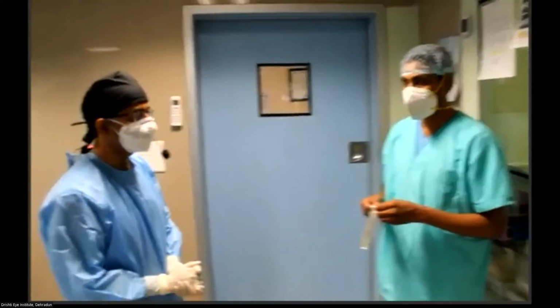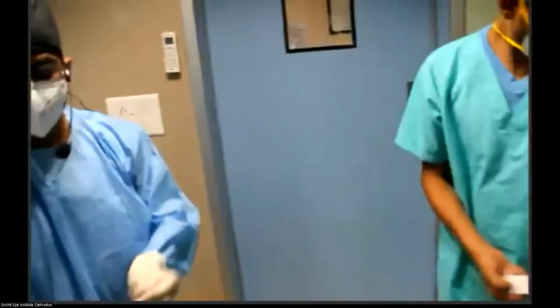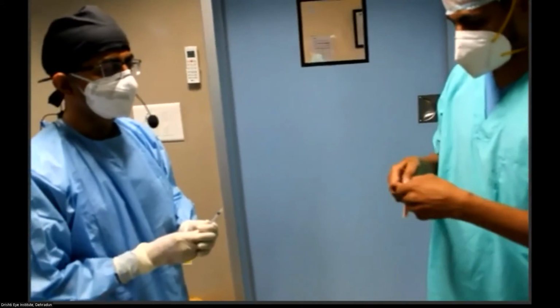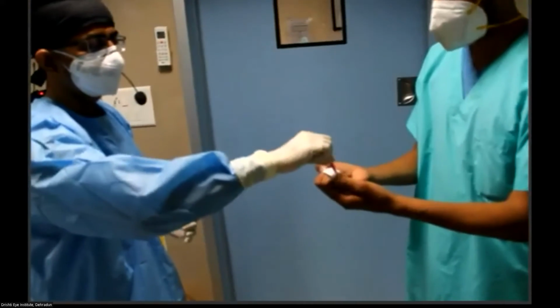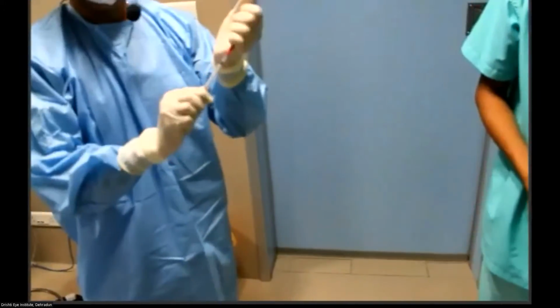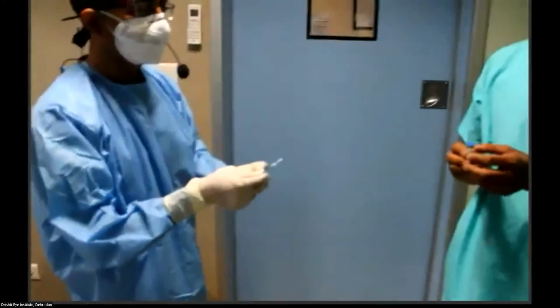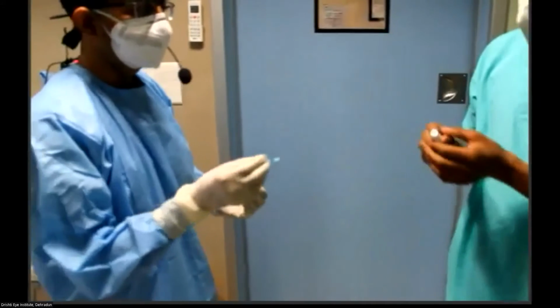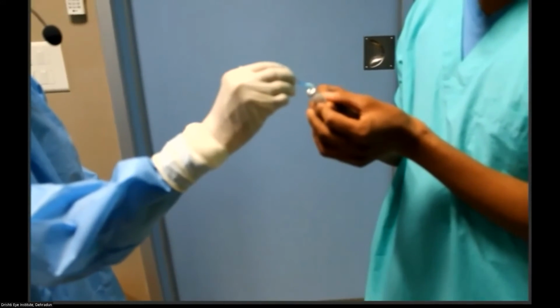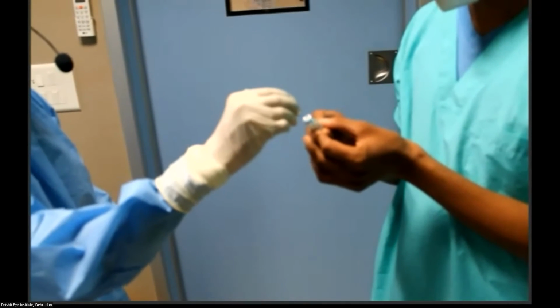So we are using a BD 1 cc syringe, and we use a spike or a needle with a filter for withdrawing the injection from the vial. And we have two cotton swab sticks which are dipped in spirit, which we clean the vial, the rubber bung part and the metal part on the side twice.